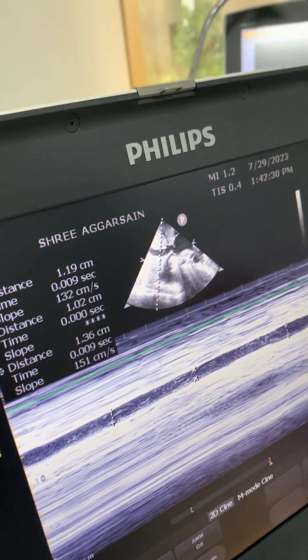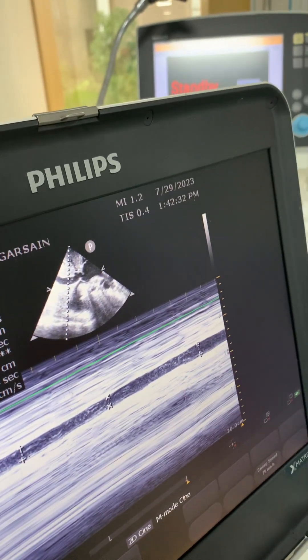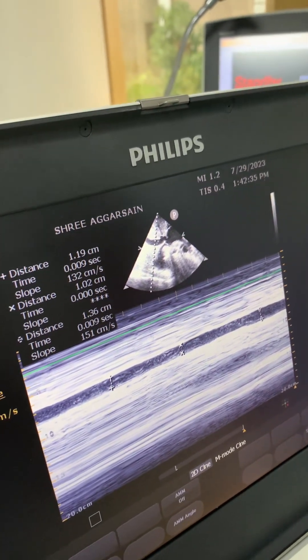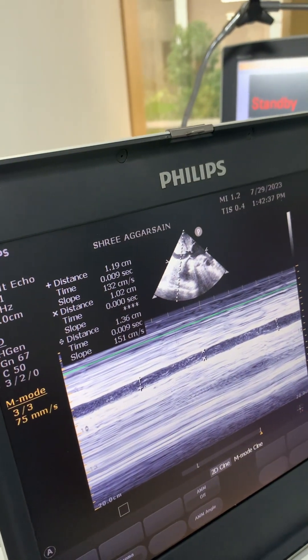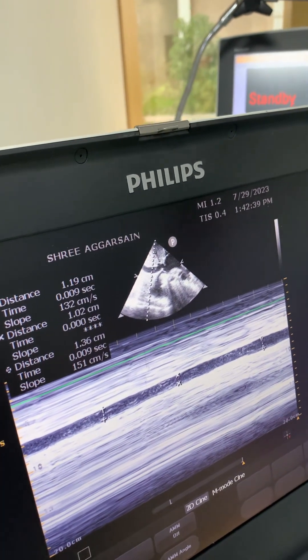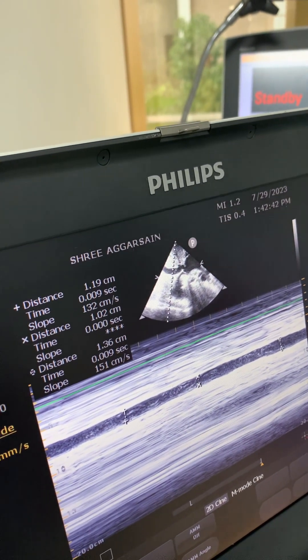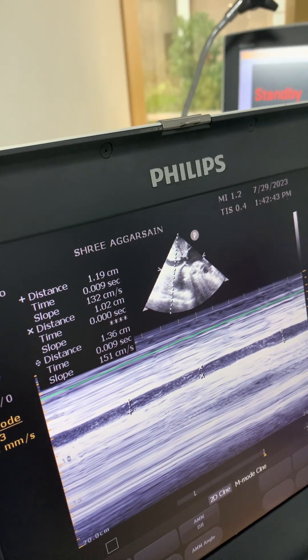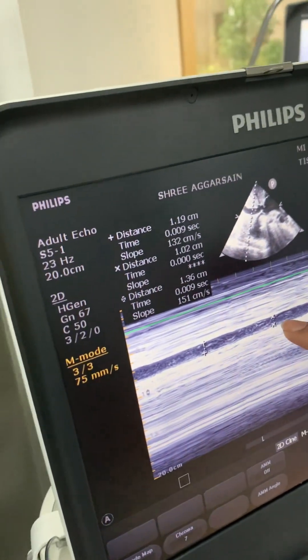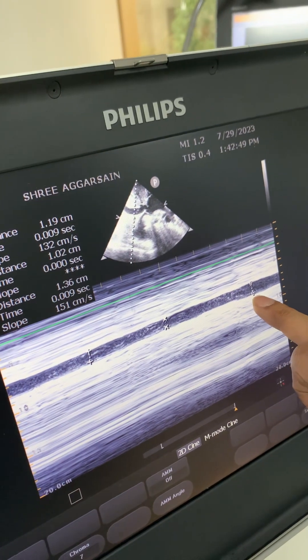If the mean diameter is less than 1.5 cm, the patient is hypovolemic. If it is between 1.5 and 2 cm, we can still consider giving fluids. If it is above 2 cm, no fluids should be given. We also need to assess two indexes: the collapsibility index and the distensibility index.